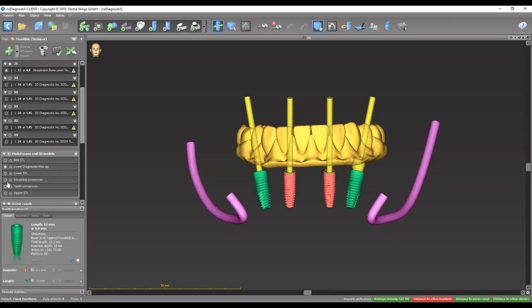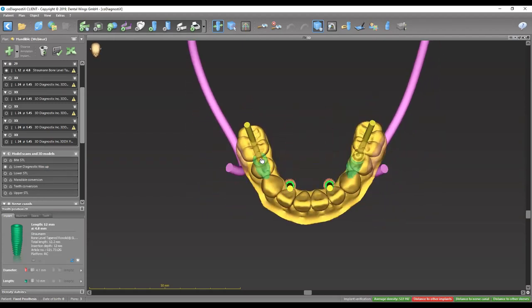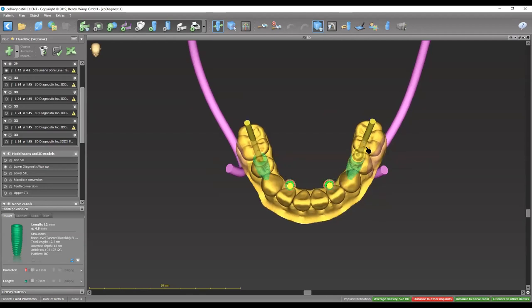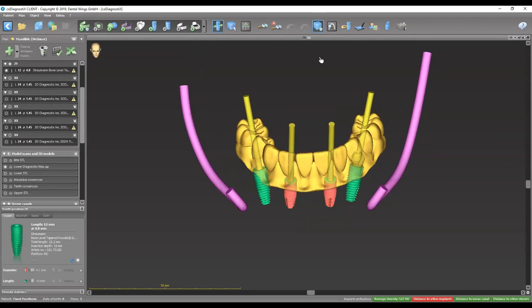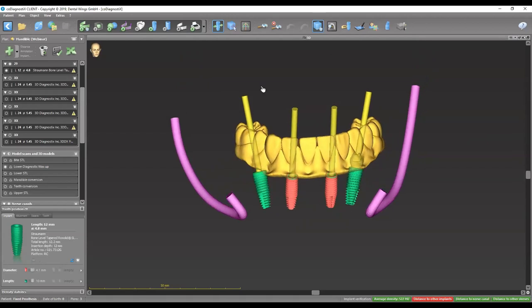That's the process of having a PMMA prosthesis and virtual wax-up made — just to make sure everything looks good with the final outcome. We design holes for the pickup on the occlusal surface of the prosthesis, and it's ready to go. This is basically what we covered today — how we approach the different treatment plans, how we plan implants to accommodate an overdenture, and how to plan for a fixed prosthesis.